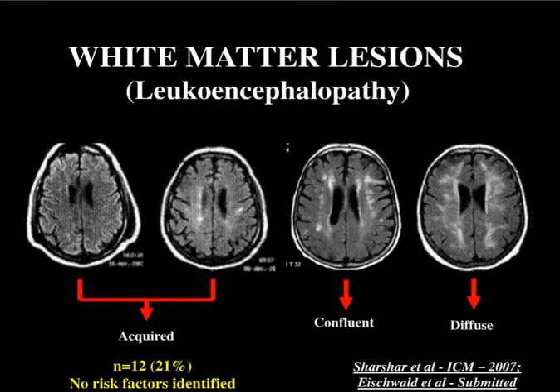This is a patient with a normal MRI at the onset of septic shock; this patient had cellulitis of a limb. We did an MRI, no white matter lesion. Fifteen days later he was completely confused, and we did an MRI and saw the appearance of these white matter lesions, which were related, in fact, to a vasogenic edema.